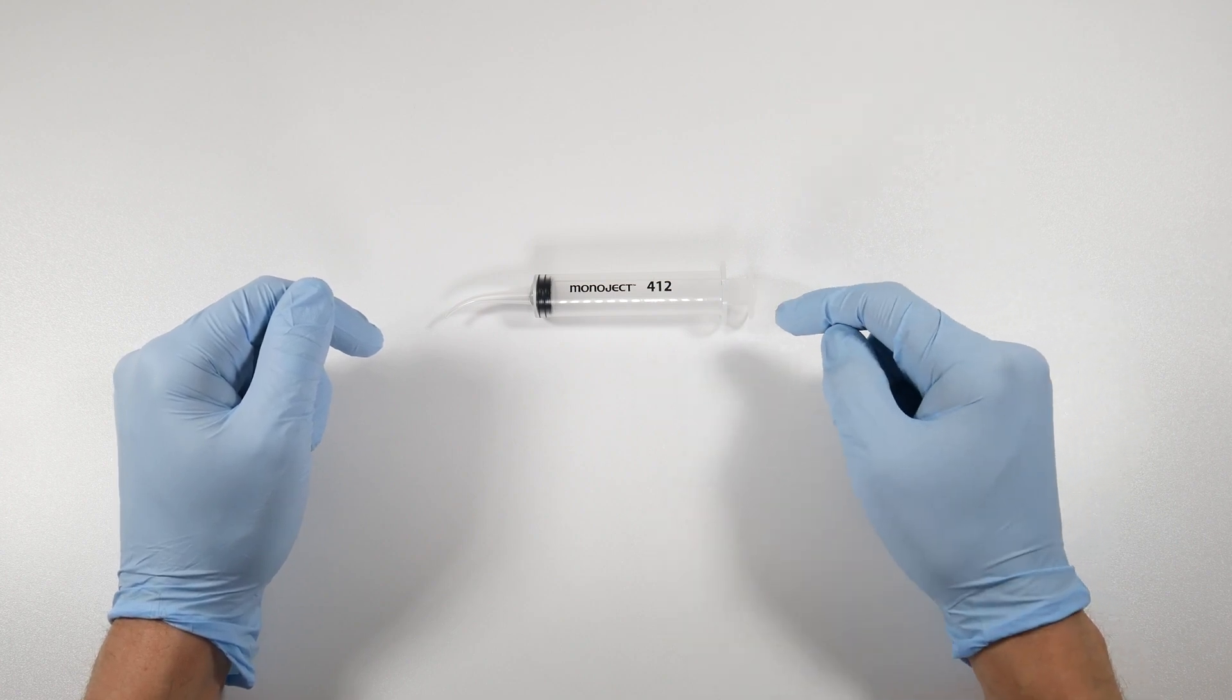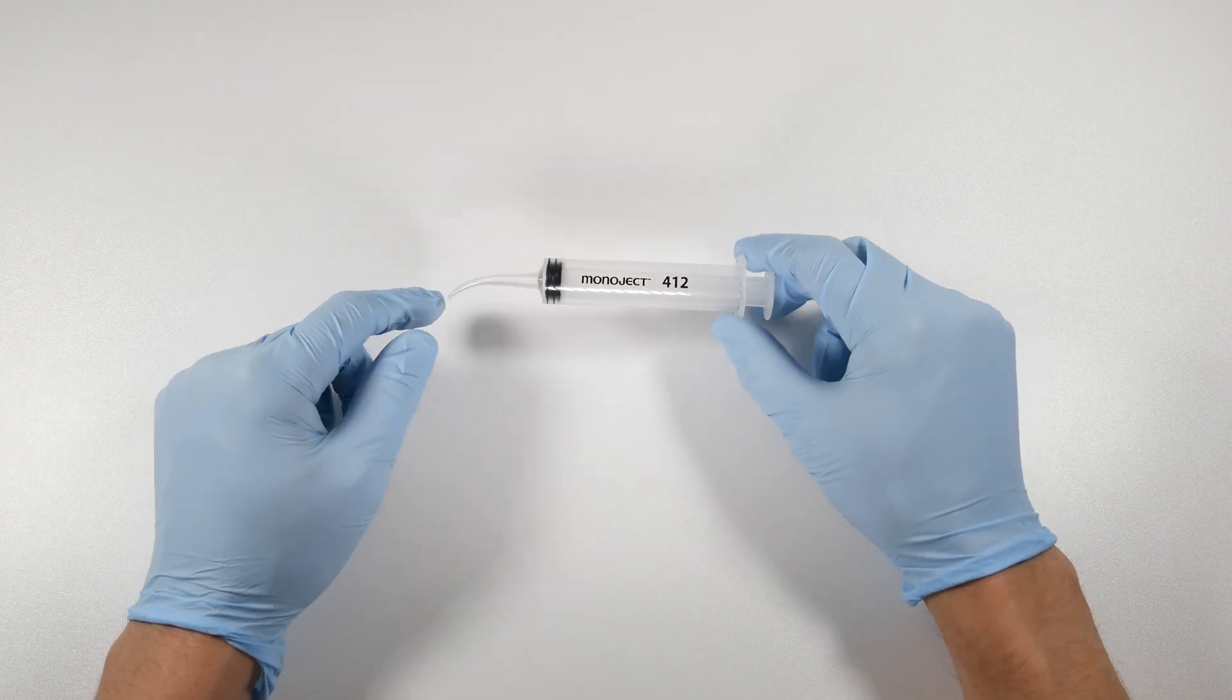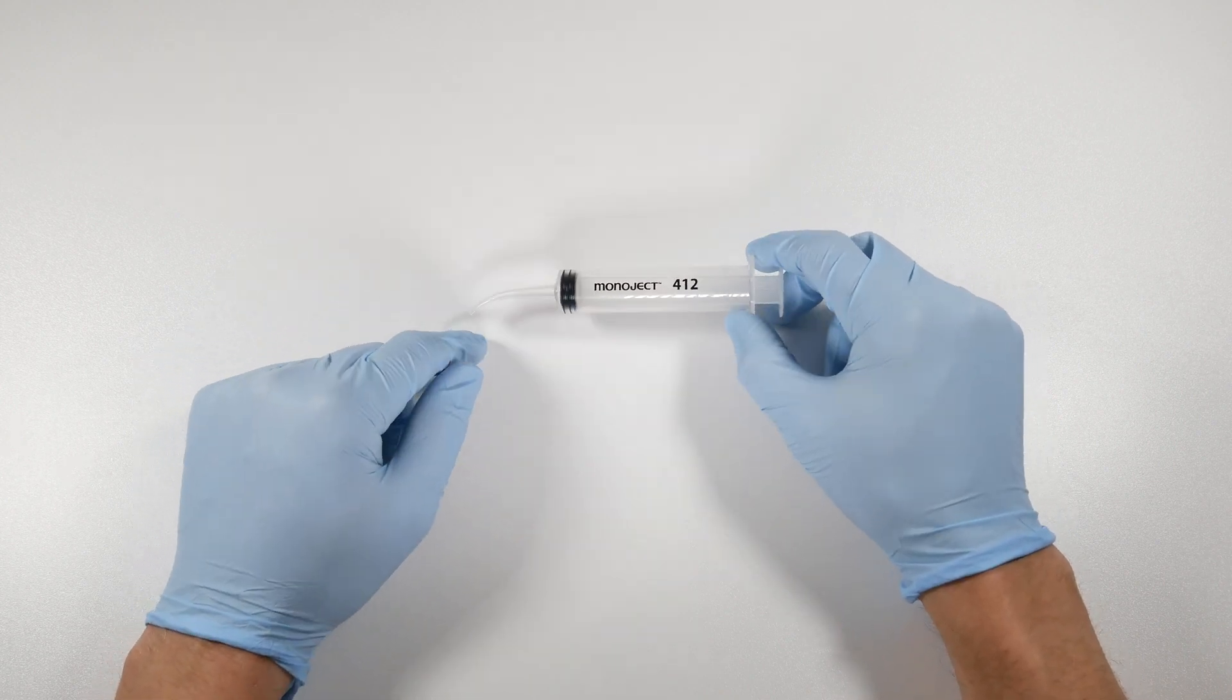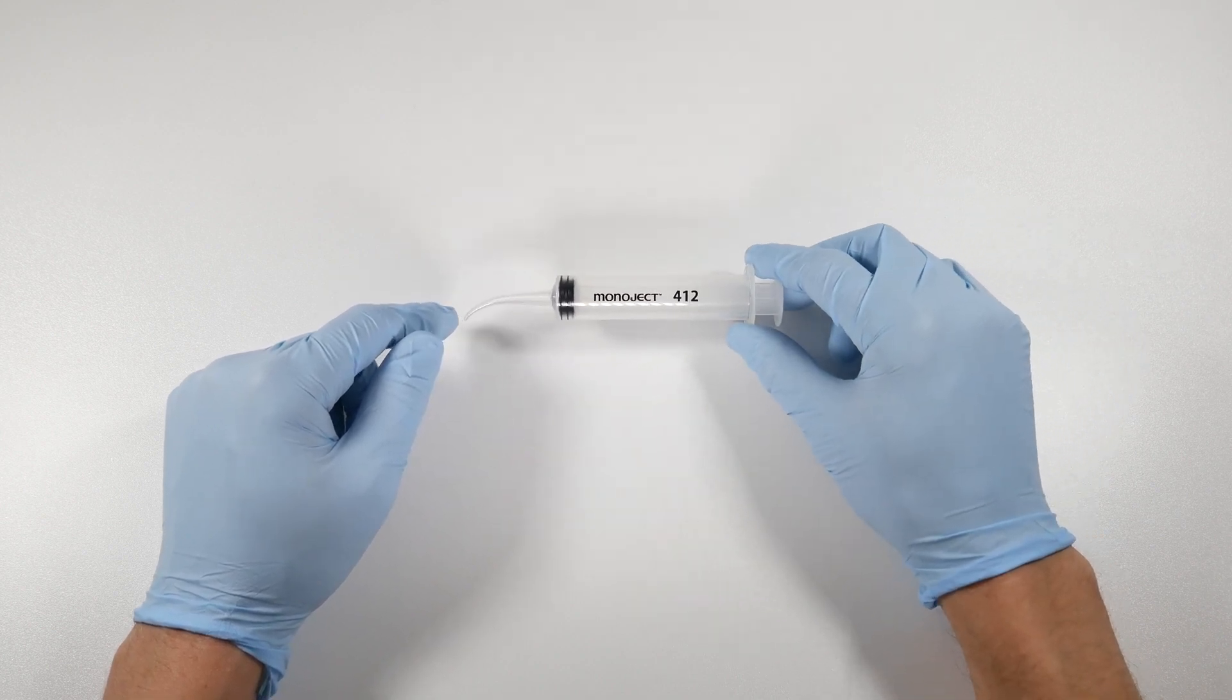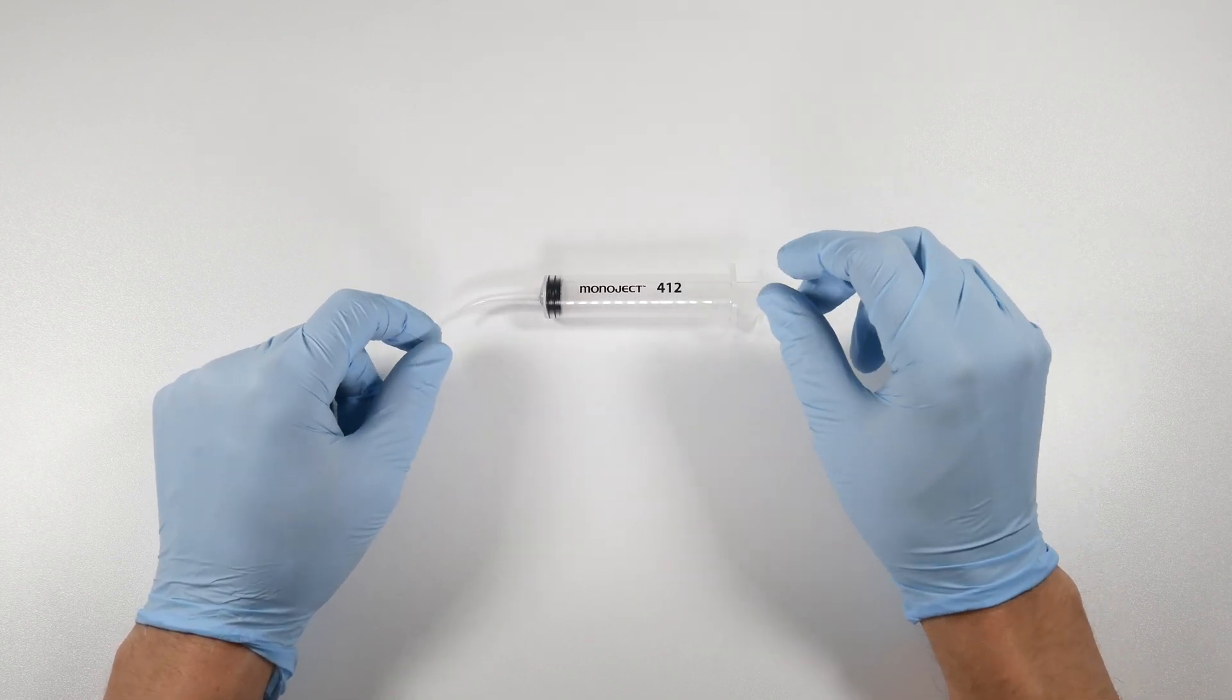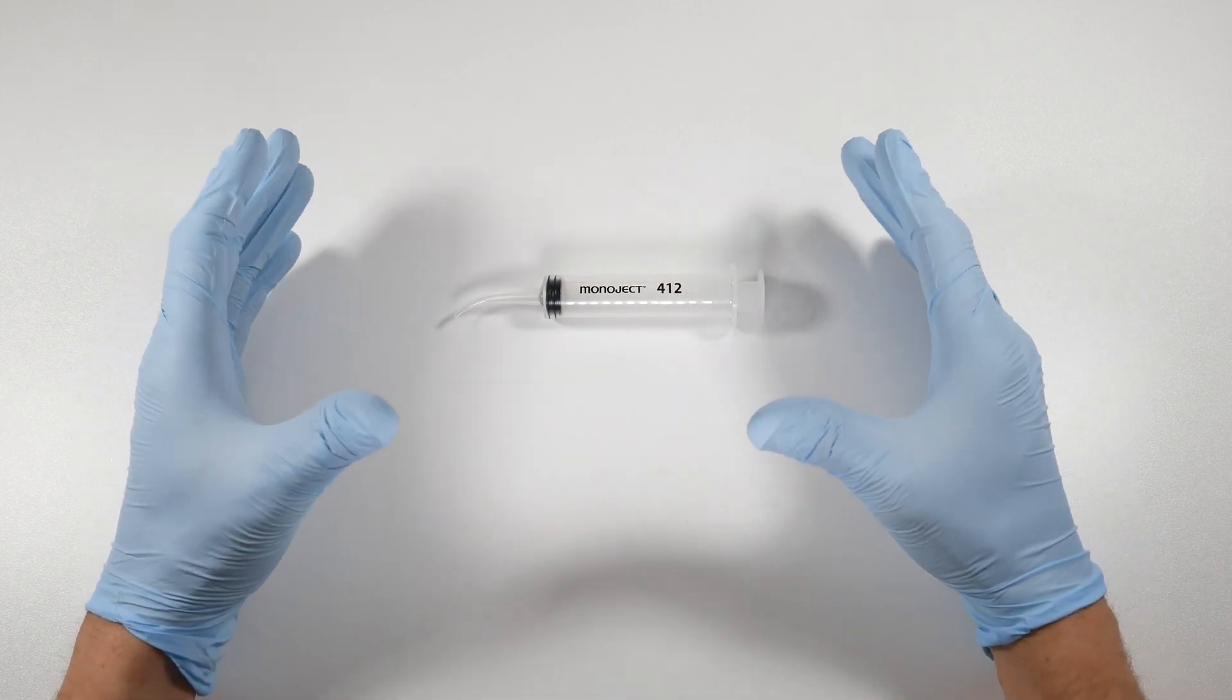If you think about that, this may not actually be sufficient. You could still use it but it means you're going to be using many of them, at least three for each site, which is kind of wasteful. You can obviously reload it but then you're ruining a big thing of sterile saline.